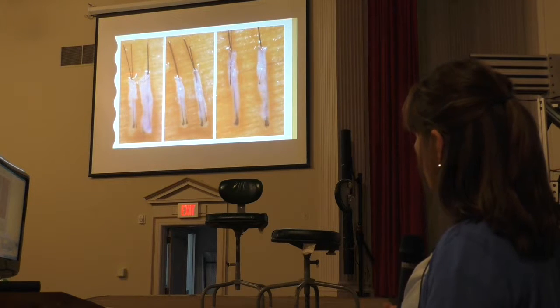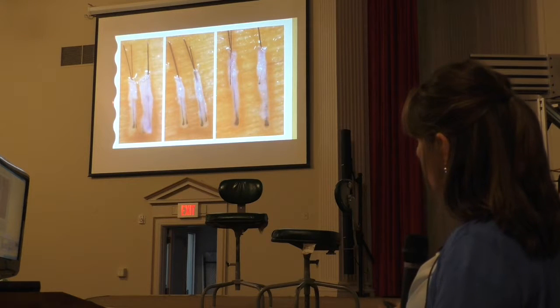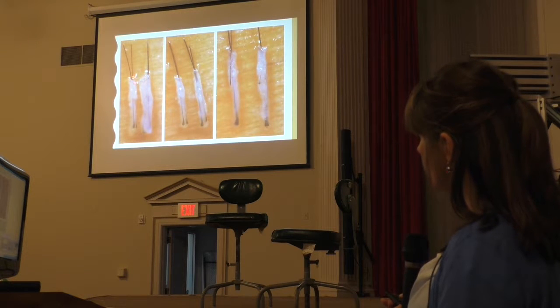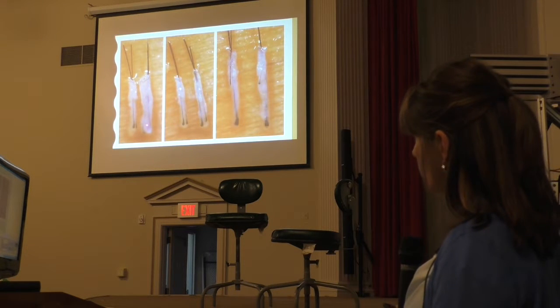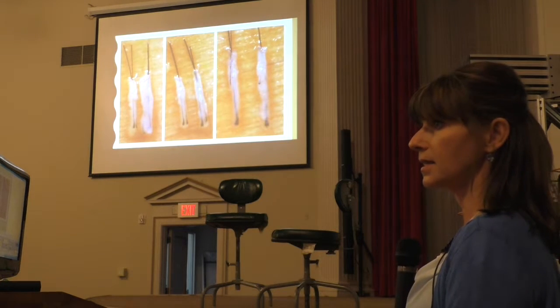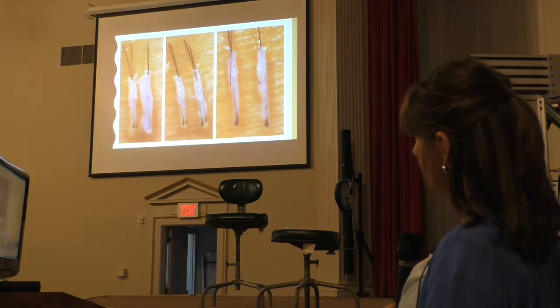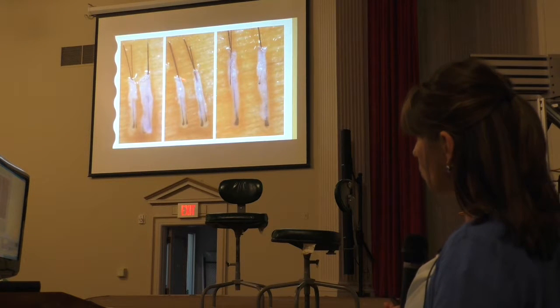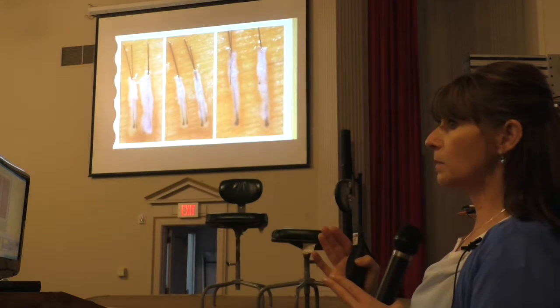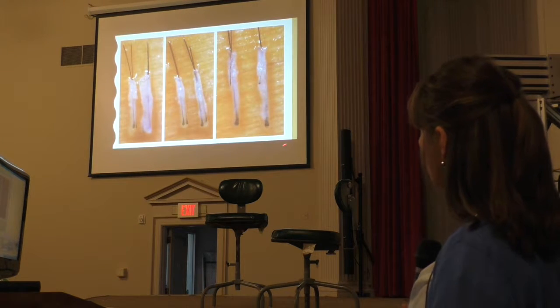In this case, what I'm trying to show is that, for example, these 2 grafts are, before being trimmed, this is what they look like once they are trimmed. Before being trimmed, it's a 2-hair graft, and this is a 2-hair graft. Without trimming, they would need 2 different size sites in order to fit properly. So the idea of dissection is that the 2-hair follicular unit grafts should occupy the same space. So the consistency in dissection and trimming is important.